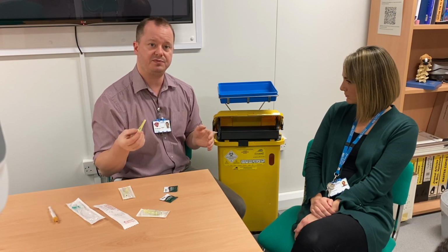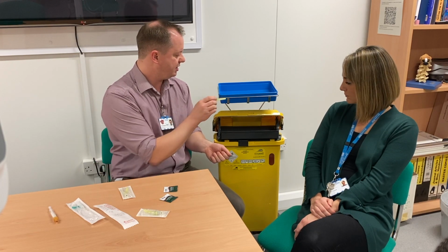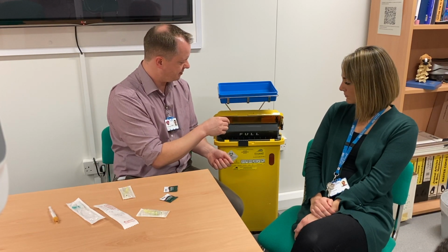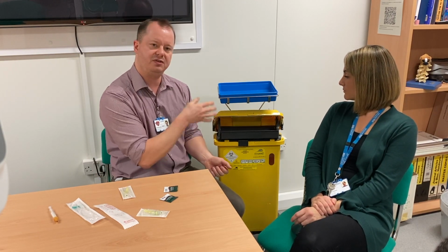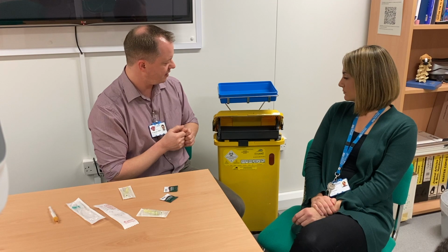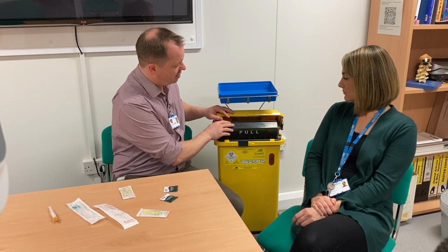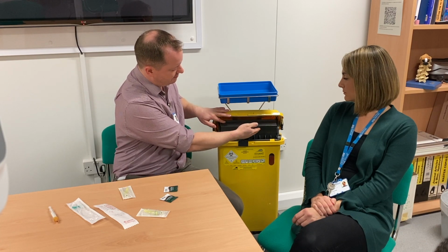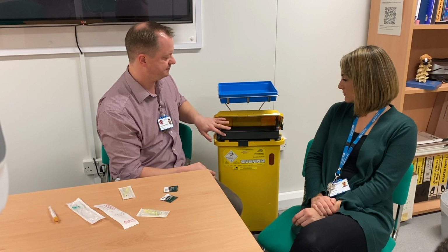If you've finished with your sharp and you want to dispose of it, you need to be able to place it into the sharps bin, and it should slowly drop into the sharps bin, and then the tray will go back so you won't be able to get to it. If the sharps bin is full when you open it, the tray won't lower all the way, it will stay up, it will stay full there, and you'll also be able to see that it's full at the side here.